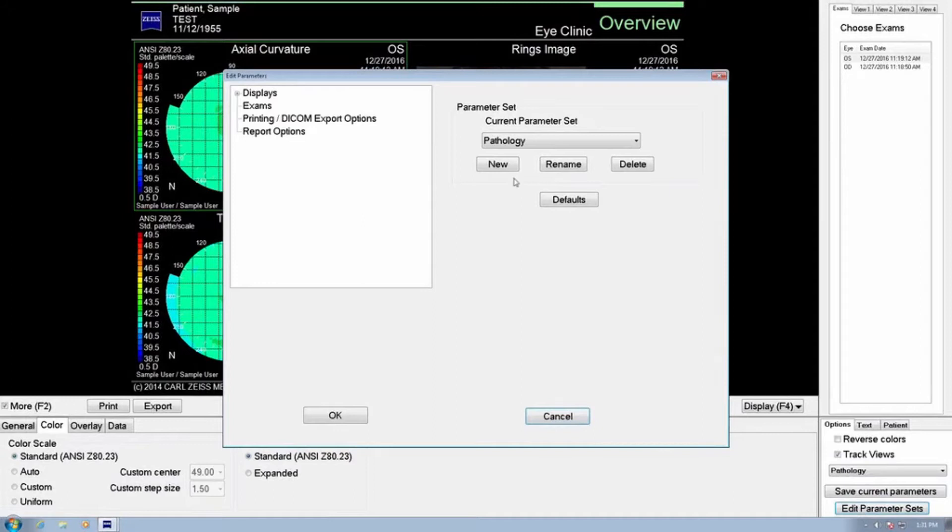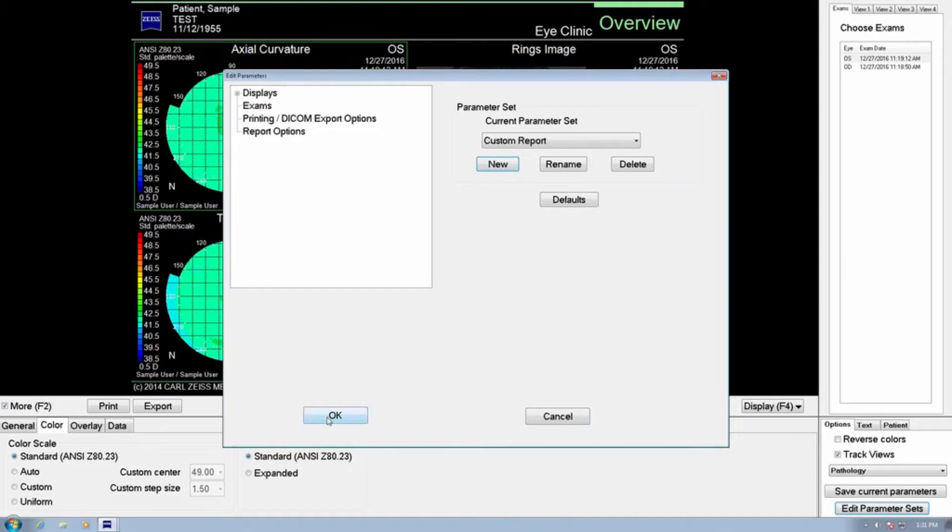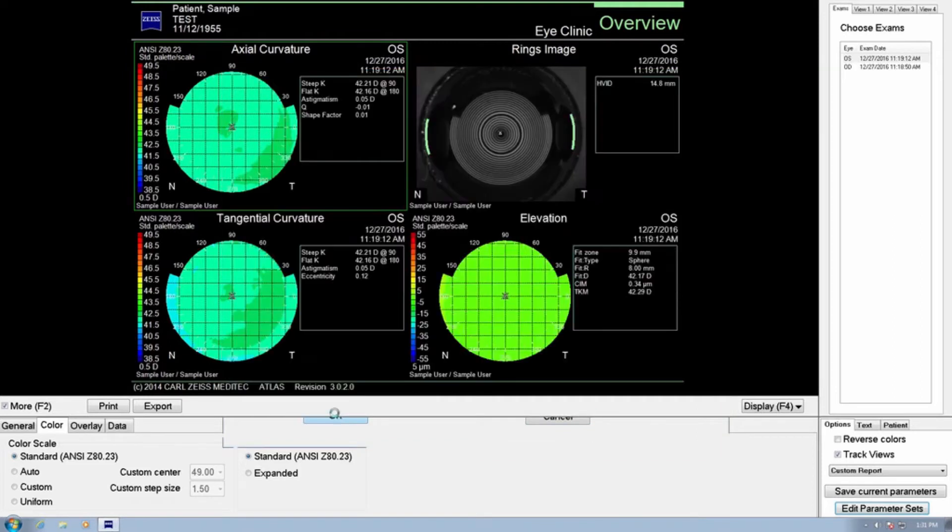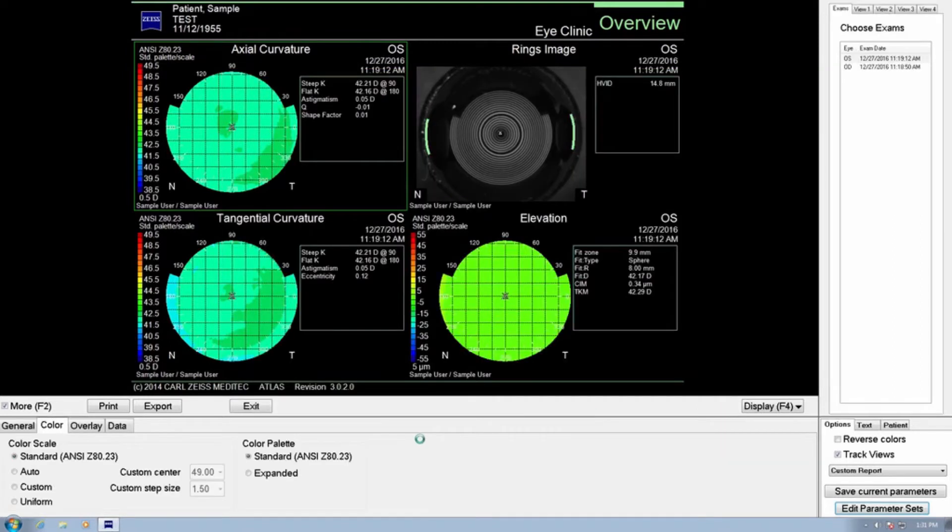Select New, Create, and type in a name that describes this custom view for the new report output. The name custom report is often used. Click OK to return to the customization menu and continue customizing your topography report.